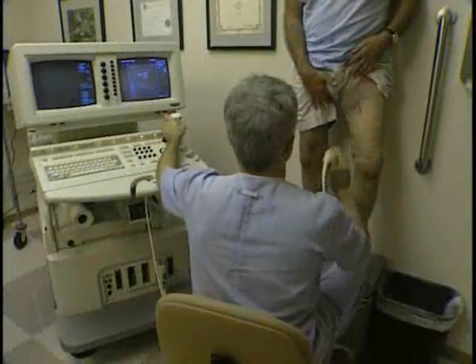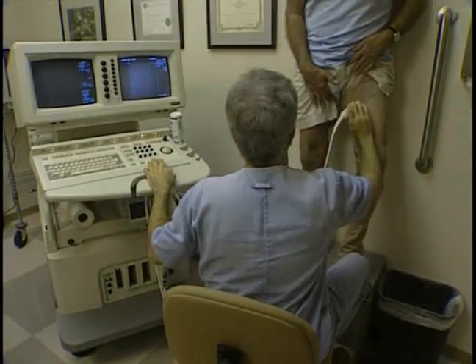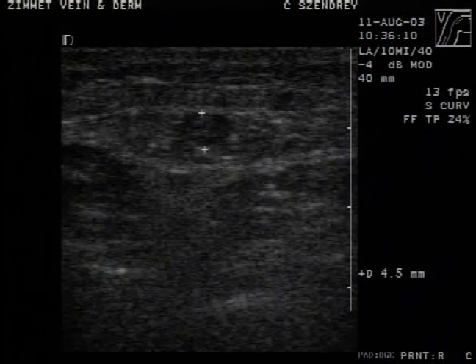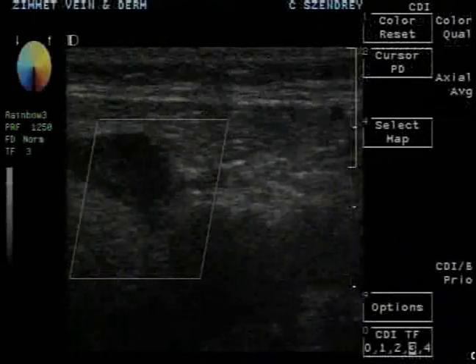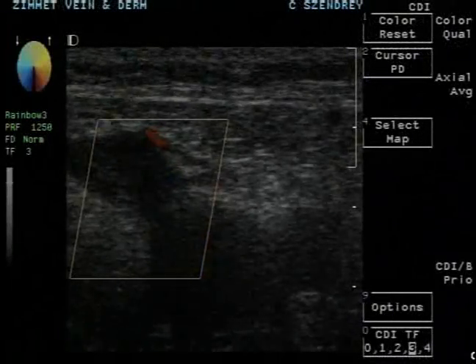The patient is seen between 3 and 7 days later for follow-up. Duplex ultrasound criteria for successful treatment at that time include a non-compressible GSV, minimally decreased in diameter, with echogenic thickened vein walls, and no flow seen within the occluded vein lumen upon colored Doppler interrogation.